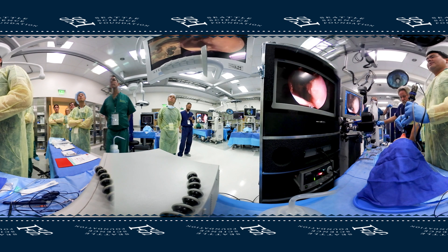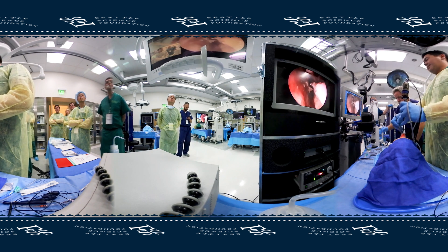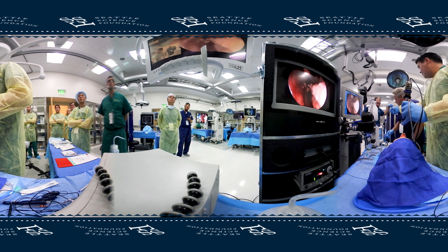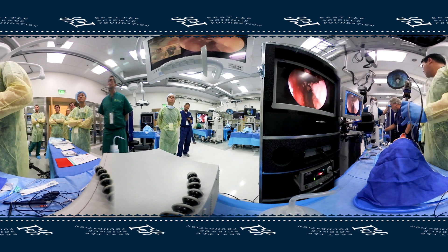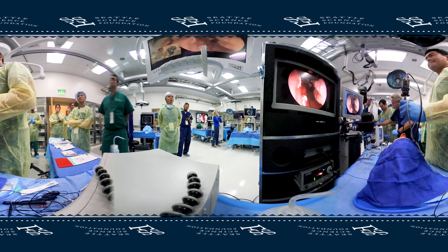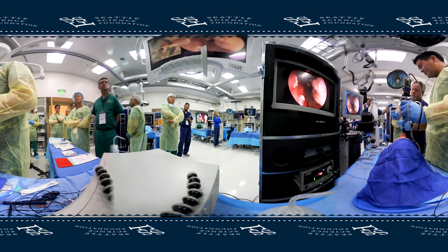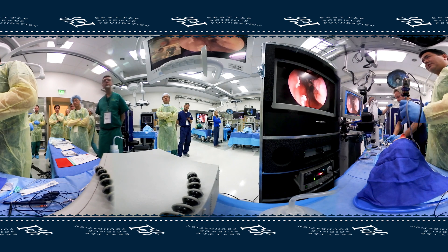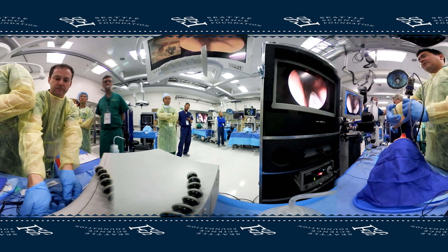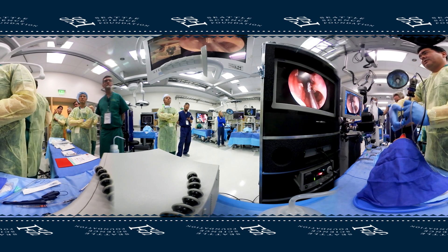The first thing we're going to do is resect the inferior turbinate. Let me have a side-biting Stenberger punch to the right. You can do this a bunch of different ways. What I'm going to do is just cut through the inferior turbinate coming from inferior to superior.